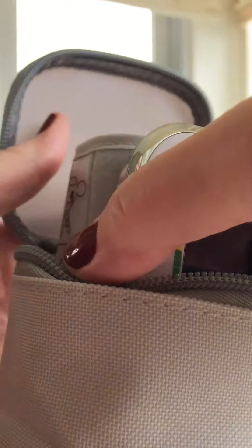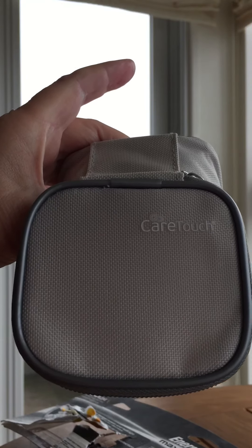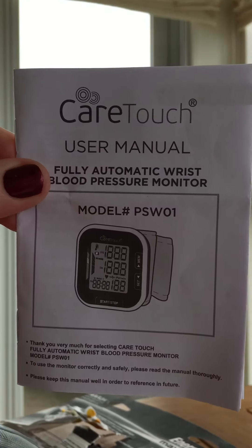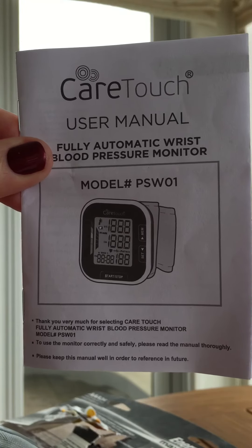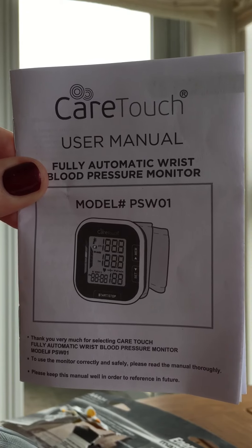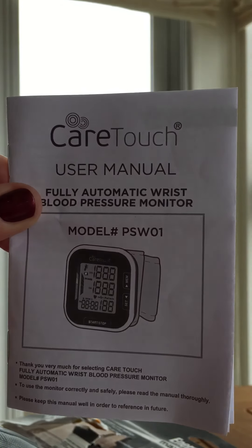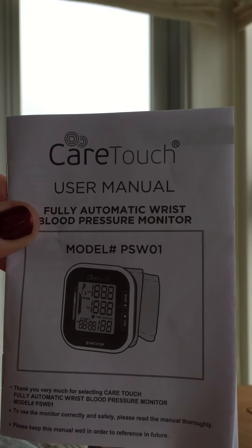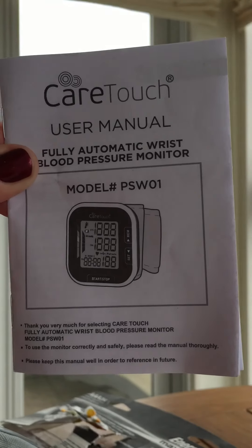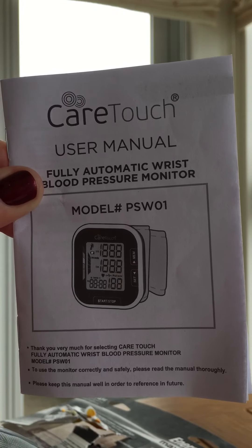I'm just giving you a tiny warning that this device does use a lot of battery power. This is the CareTouch model PSW01, the fully automated wrist blood pressure monitor — I would highly recommend it, but I'm being totally upfront: it drains battery life significantly. So that's my update from Julie Hankinson. You all take care and I hope you're having a good weekend — bye!